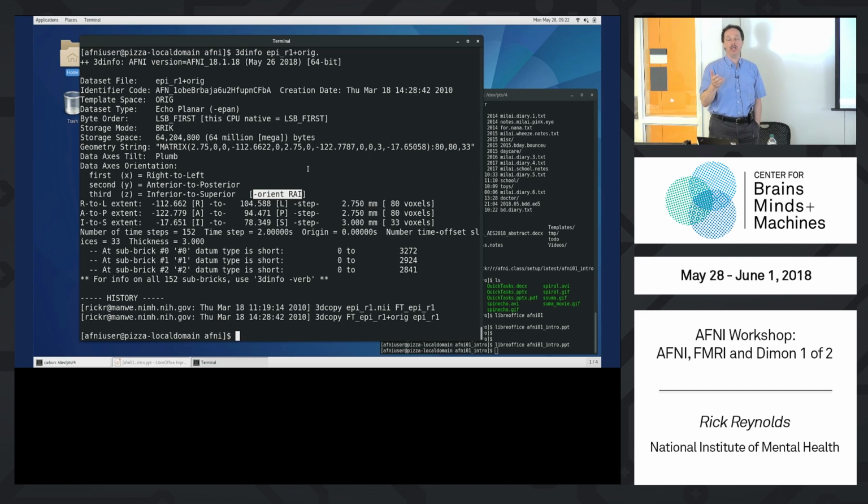So to some degree, in your paper, having a coordinate negative 17, 22, 31, you might not list all the coordinates like that. It's unambiguous to say 32 left, 14 anterior, 15 superior, whatever. If you put something in there that says exactly this is left rather than negative, then it's not ambiguous.